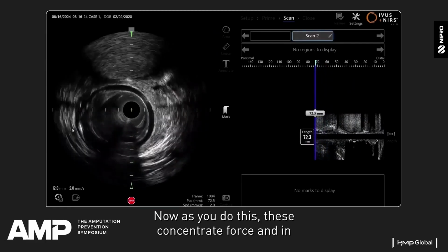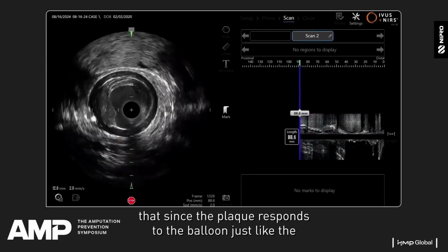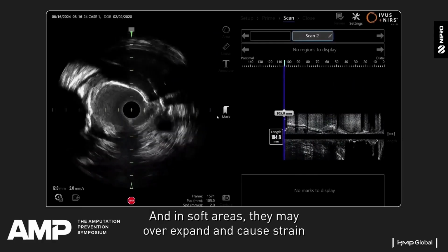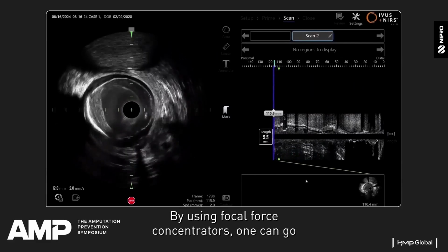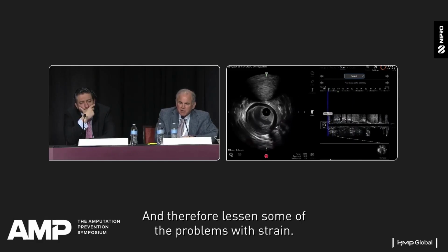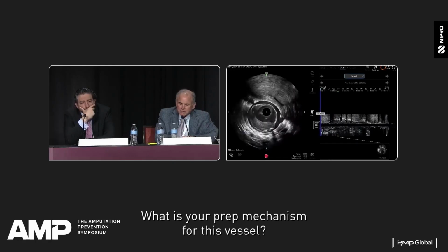Now, as you do this, these concentrate force, and in densely calcified lesions, since the plaque responds to the balloon just like the balloon is treating it, in areas that are ultra hard, the balloons may not wish to fully expand, and in soft areas they may overexpand and cause strain issues. By using focal force concentrators, one can go up slowly and usually achieve more uniform inflation of a lesion, and therefore lessen some of the problems with strain. So are you planning to use focal force here, Pradeep, or shock wave or something? What's your prep mechanism for this vessel?